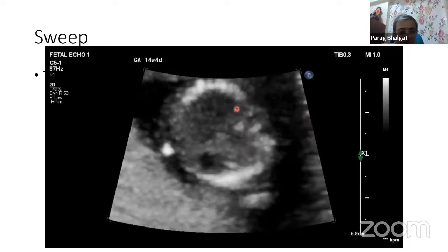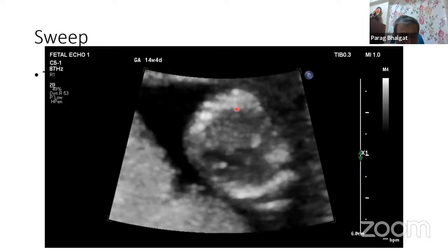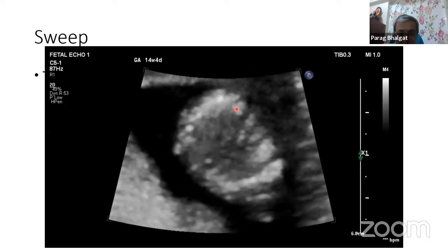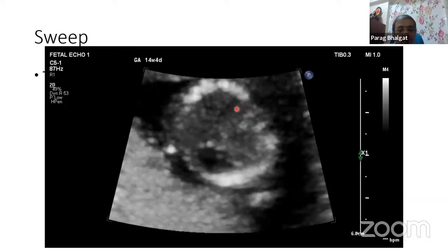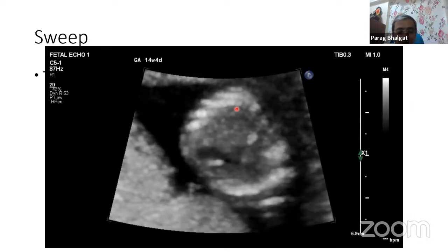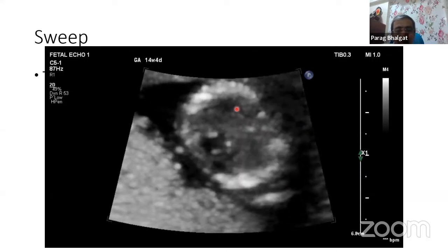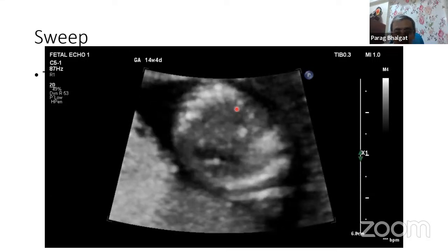Sometimes it can be confused with a single ventricle. It's okay. Spend your time. This fetal echo sometimes may take 1.5 hours to complete because the baby keeps on moving. It's a small baby. Orientation is not fixed. Sometimes it's prone, then it goes to supine and lateral views.